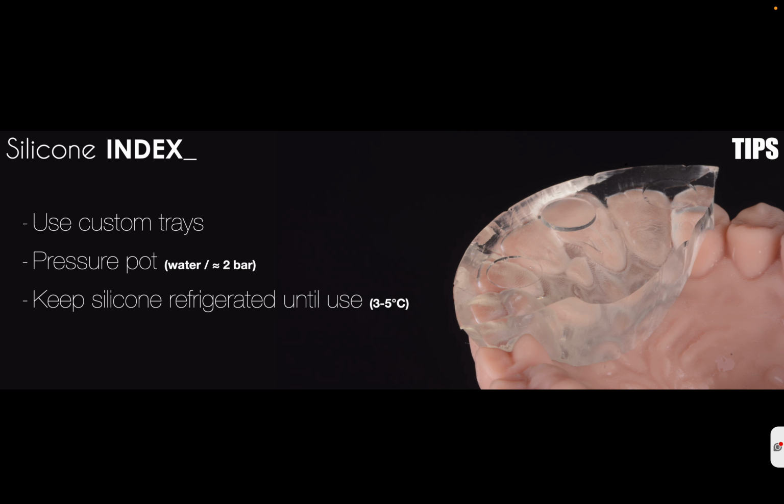Recommendations about the silicon index: whenever you can, do a custom tray index, or if not, you can select a stock tray. If possible, put the silicon, the tray, and the model, while the silicon is setting, inside water under pressure, because this silicon is going to fit better, and the adaptation of this silicon is going to be better.